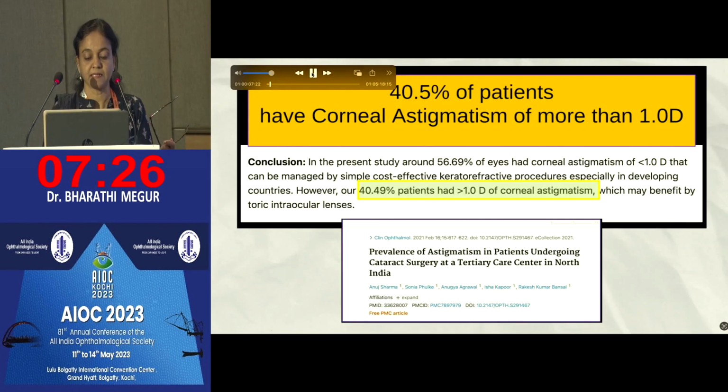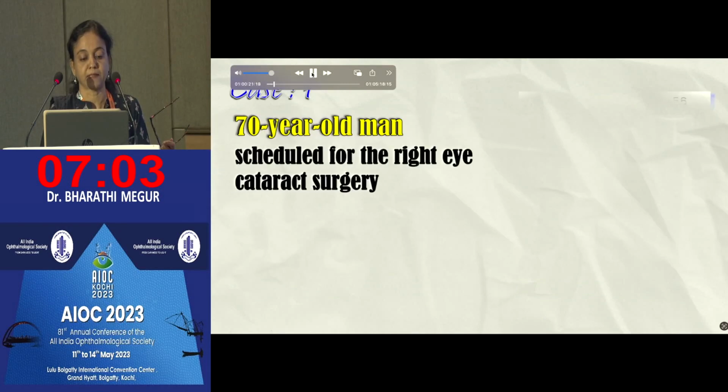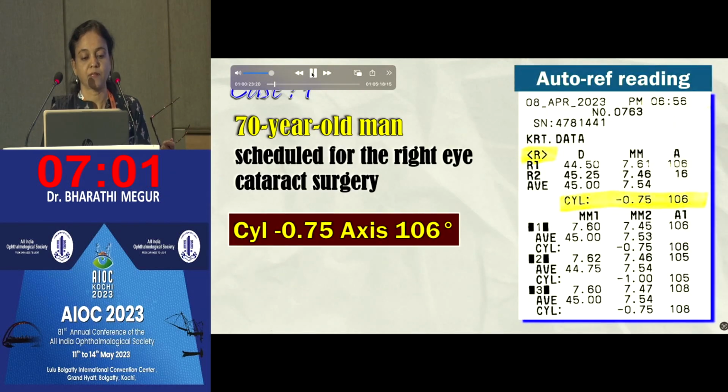And as we see, the scale of the problem is that almost 30% of the cataract patients who require surgery would require a toric IOL. This would mean every 2 to 3 patients out of 10 would require a toric IOL. This is justified by all the data and statistics obtained from all the journals. At least 30% of our workflow would require a toric IOL.